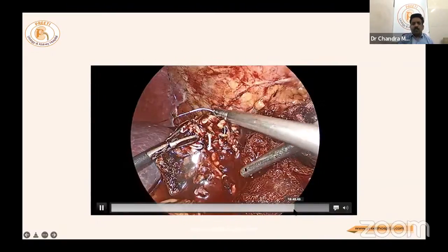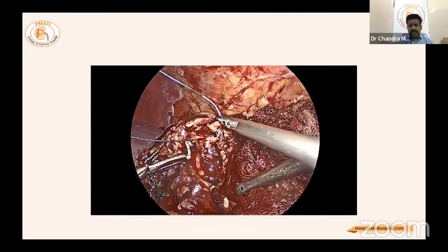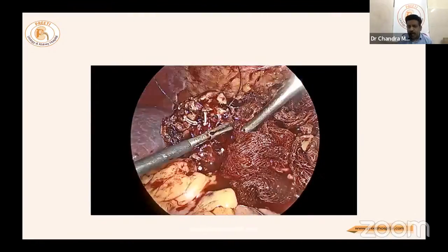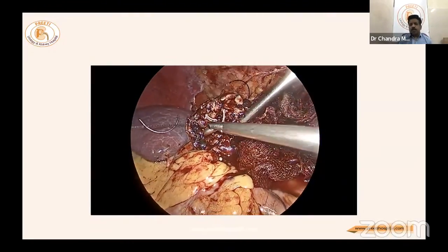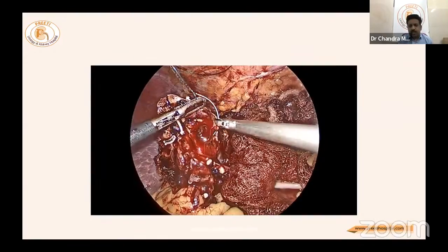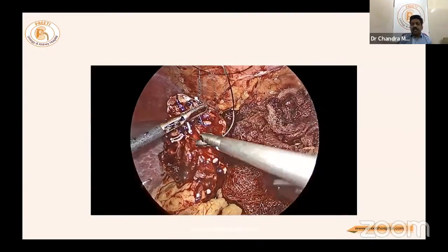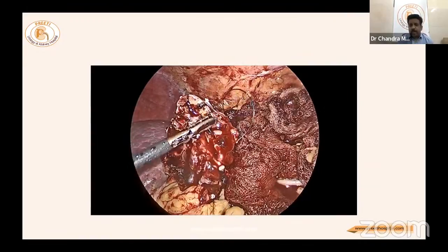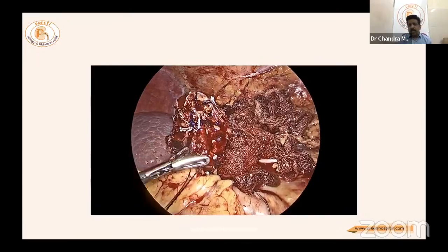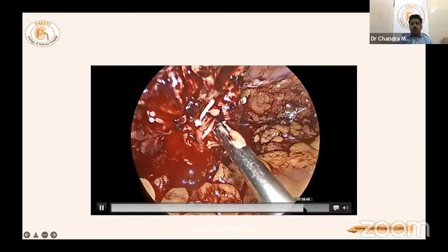After injecting contrast saline, one small leak was found. Do not be overly meticulous — these usually heal. If confident, apply one or two stitches close to the leak and come out. Deep bites that close the vessel will cause the kidney to become ischemic on the table. With this, the parenchymal hemostasis portion is complete.